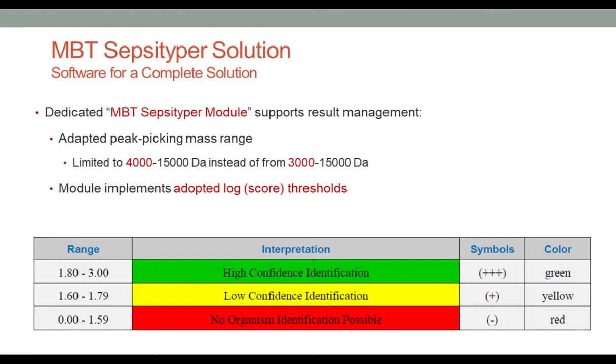Did you look at the mycobacterial or SSBA organisms? I'm not sure what that question means. If it's mycobacterial questions, okay. For our blood cultures, we did not.